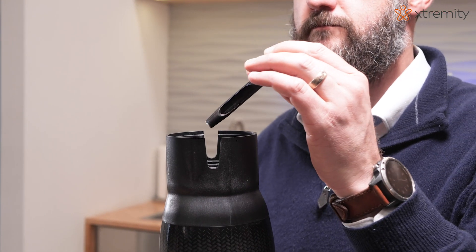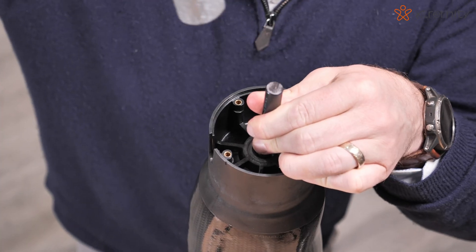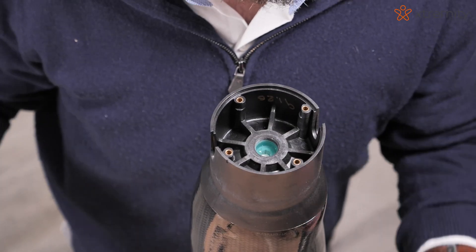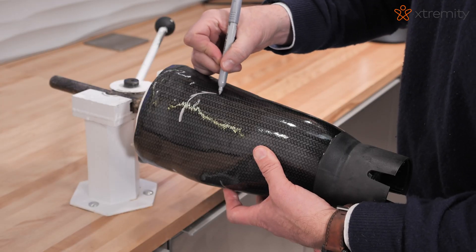Place a 5/16-inch hole punch into the center of the distal base threaded hole. Punch a hole through the silicone until it reaches the limb model. Draw your socket trim lines and trim the socket.